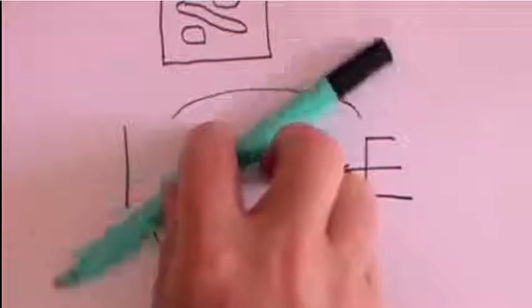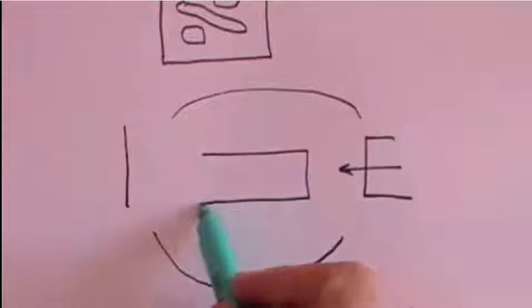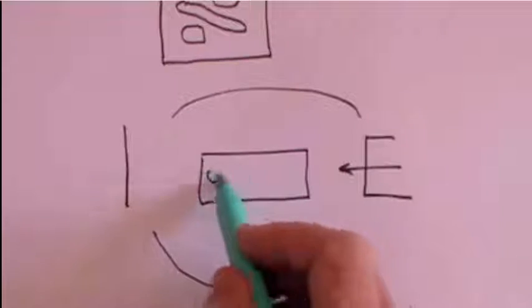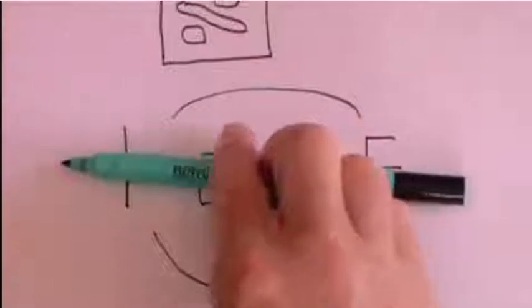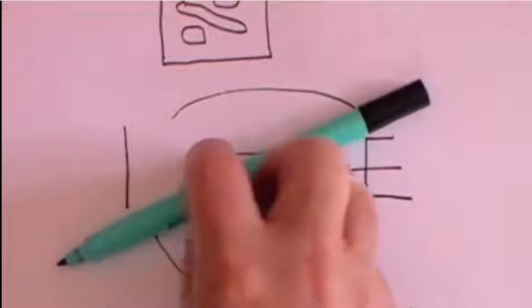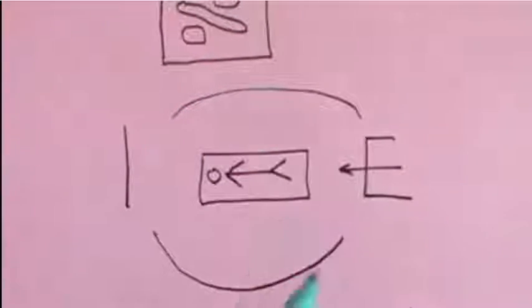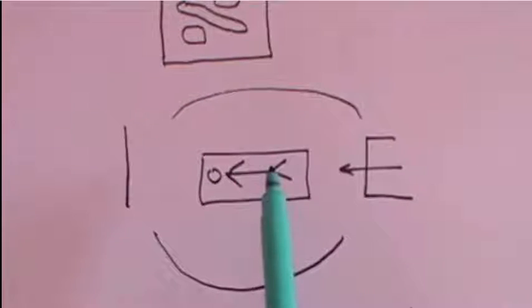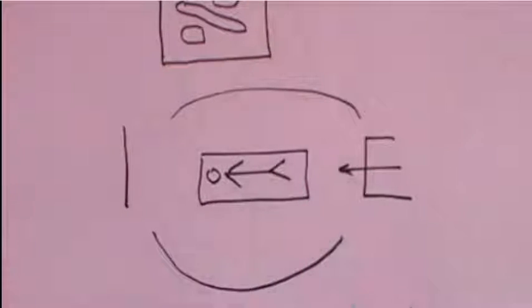This spin allows us to visualize the image from different angles. Then the image processing software takes the pictures and arranges them to reconstruct and give us a three-dimensional image of the object.